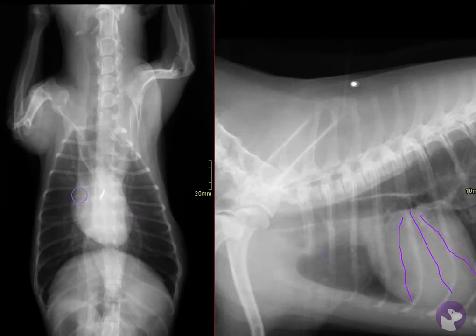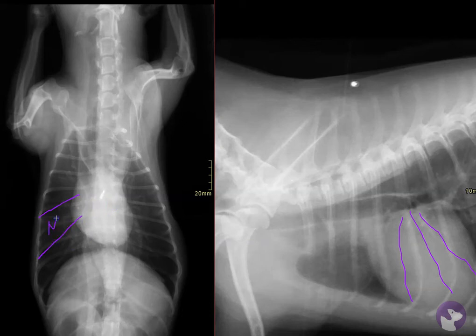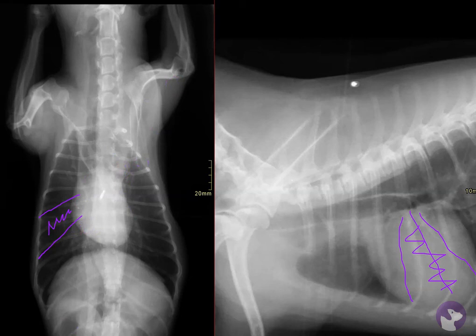Of course, this also occupies this area in the ventrodorsal projection. So if we find an alveolar pattern within those regions, that would be something to worry about — remembering that the alveolar pattern can be distributed in multiple different lobes, but is most often ventral when aspiration is the underlying cause.